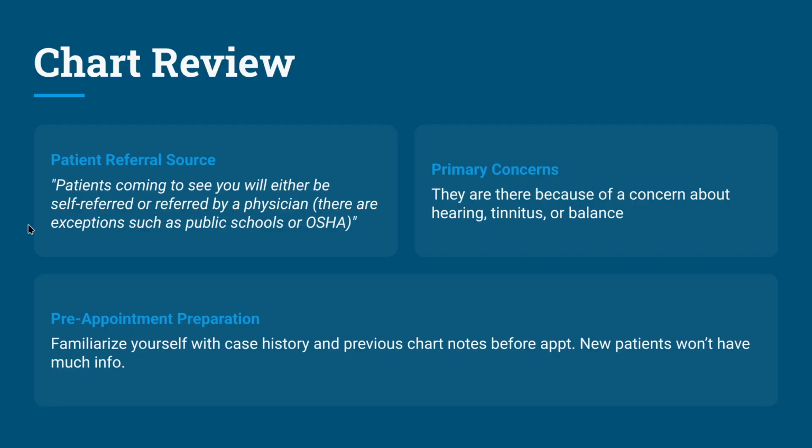Is their referral coming from an atypical source, such as, is it related to a hearing conservation program? Maybe they're being referred to you by a hearing conservation company or a workplace employer. Maybe they were being referred to you by public schools. Those are all common referral sources. And what is their primary concern? It's typically going to be hearing issues, tinnitus issues, or balance vertigo issues. Those are going to be the three mainstays of audiology.